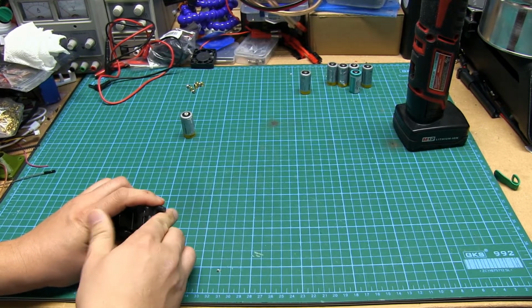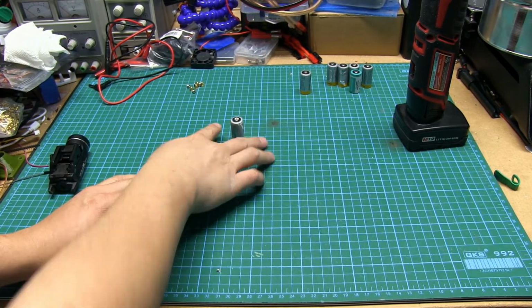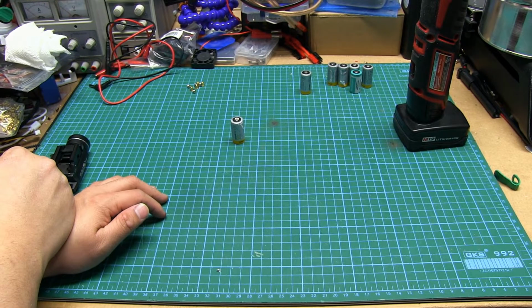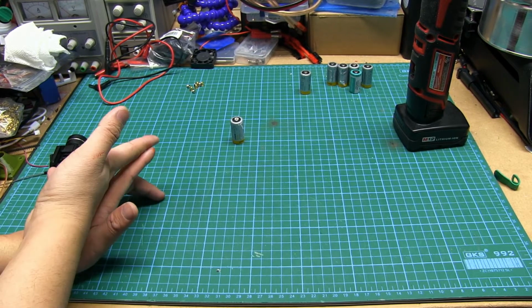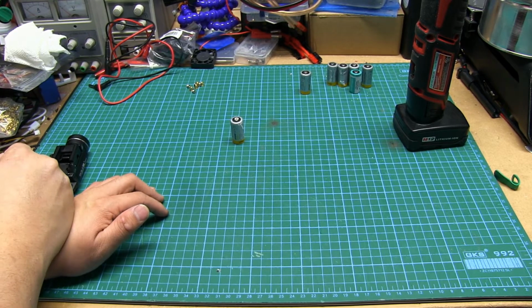And leave a message in the comments if you have done similar teardowns on these defibrillator batteries. They all seem to share a common heritage of these CR123 primary cells. They have a good shelf life and not much more to them.